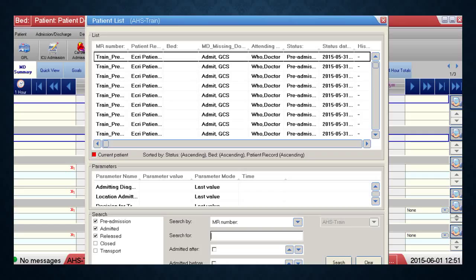When using the Patient List, be aware of the left-hand side where patient statuses are listed. Patients can be admitted to the ICU, discharged from the ICU (called 'released'), or archived — meaning the file has been reviewed, quality assurance is complete, and the file is closed. You can still open and review an archived file, but you can no longer make any changes to it.